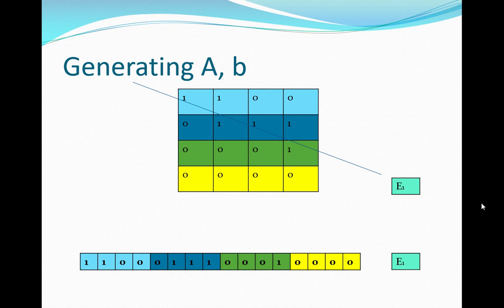This is one row of the A matrix. It says the path it took, and this is the energy loss that should be, right? X is what was in there. The very first entry of X is, in this case, the relative stopping power of that particular voxel. The second entry in X is the stopping power of that voxel. And all you're saying is, 1 times the first entry means count that stopping power in the equation that added up to that path length.